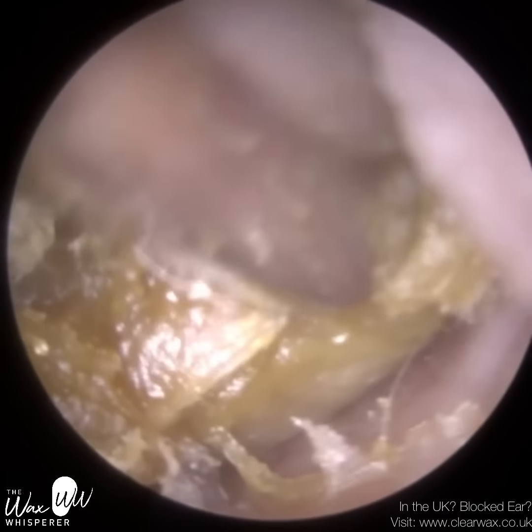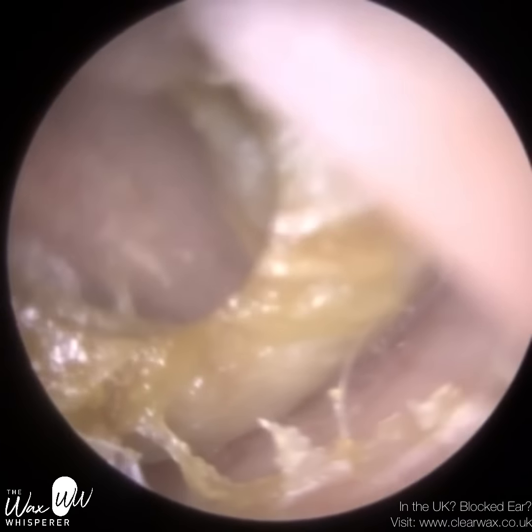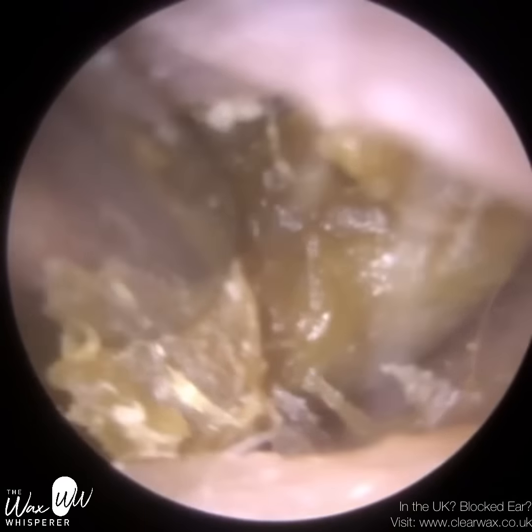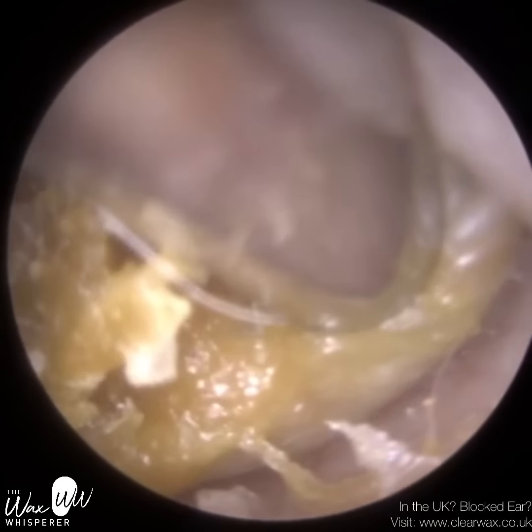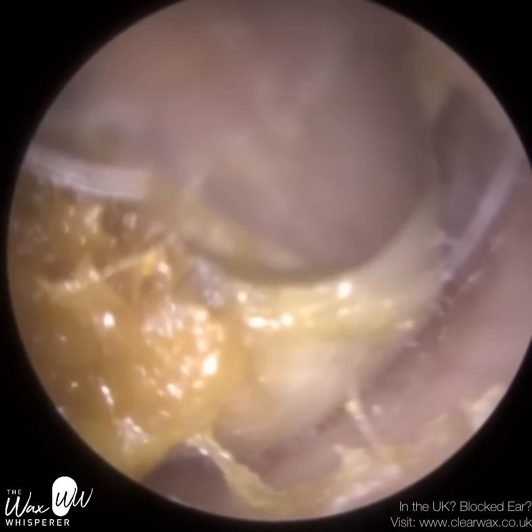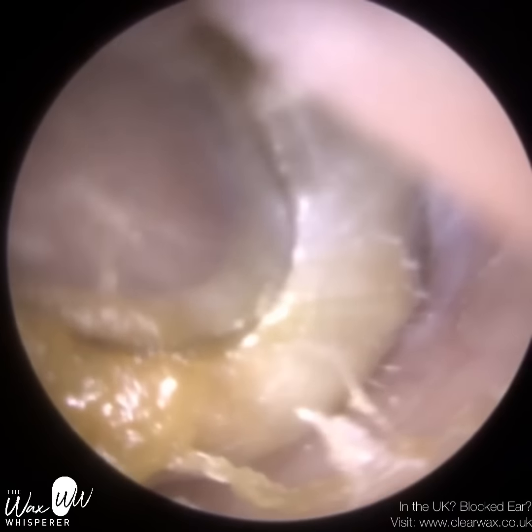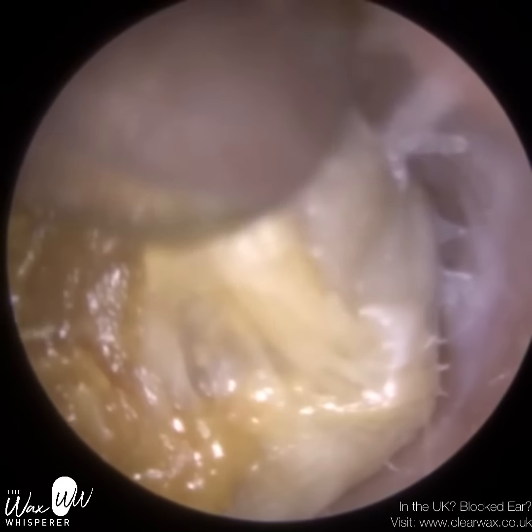It would appear that they've got glue ears, so a buildup of infectious fluid. It has a glue-like consistency, and it's the smallest of perforations, and you can actually see the fluid behind the eardrum, and the eardrum itself was pumping, it was beating, and this fluid, it was leaking out. So it's almost like that little hole was almost like a valve.